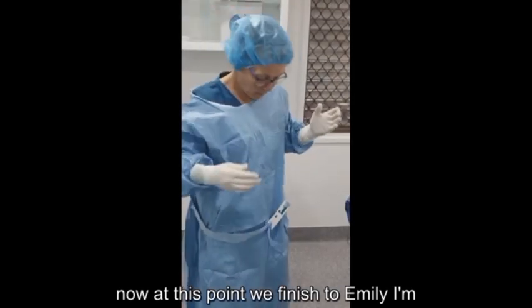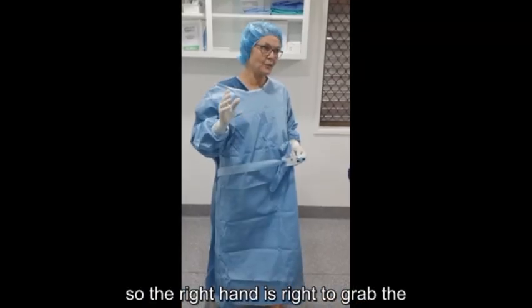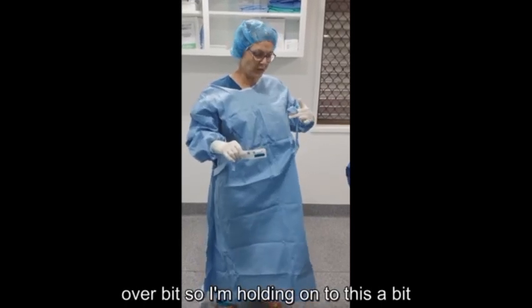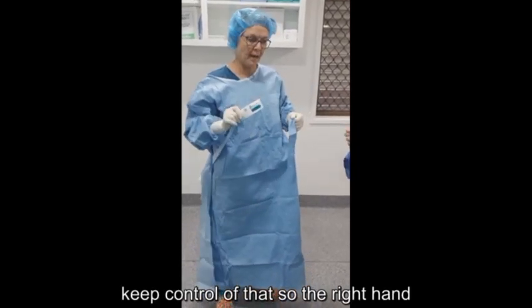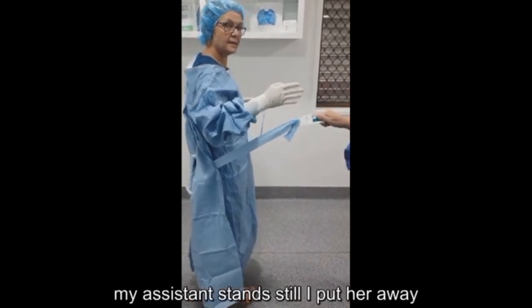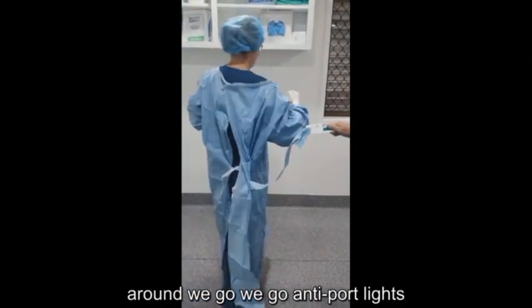Now at this point we've finished, so Emily, I'm going to ask you to grab this tag for me. The right hand is right to grab the cardboard, the left hand grabs the leftover bit. So I'm holding on to this bit. Don't just drop it. Keep a hold of it. Keep control of that. So the right hand is right to pass across to my assistant. My assistant stands still. I pirouette. Round we go anti-clockwise.